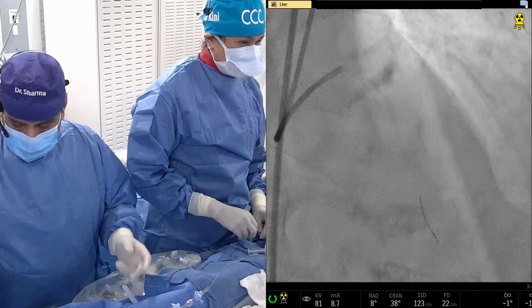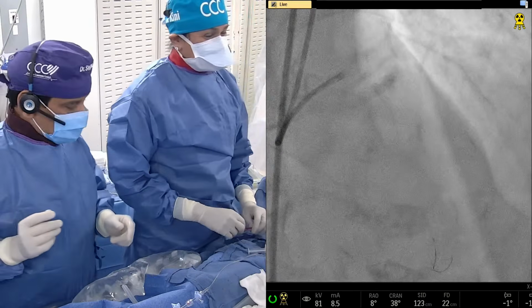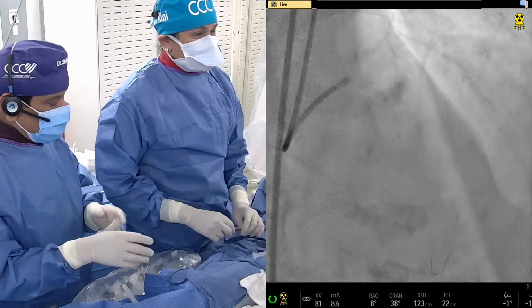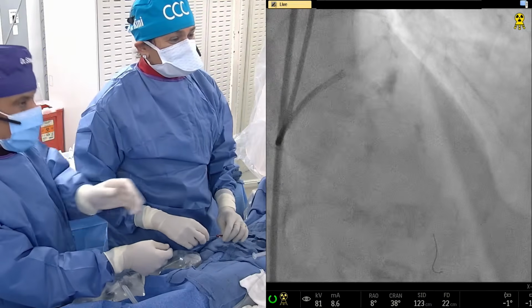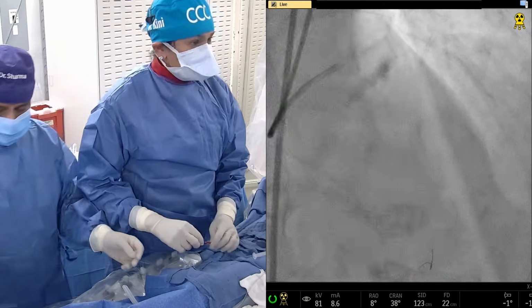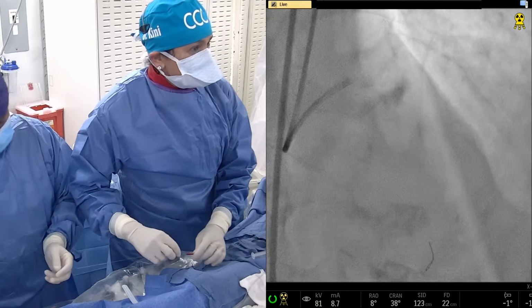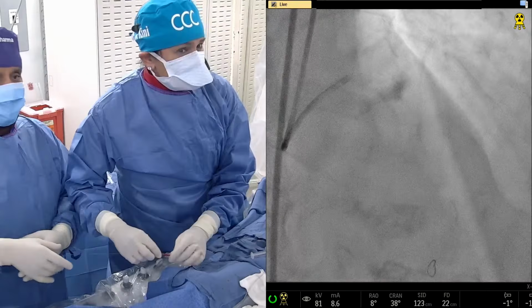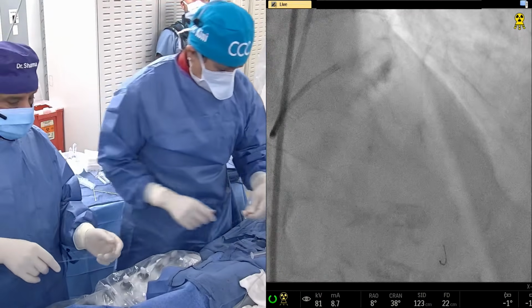I will learn a few things from there. The diagonal is almost as big as the LAD. I think we use the 1.75. Do you want to do IVUS now or after Rota? I think you do 1.75 first. I know you like aggressive, but let us teach imaging guided. So let's do the IVUS. You know how you are going to select the burr, and do we have that algorithm ready? Yeah, it's ready. Do we show it?